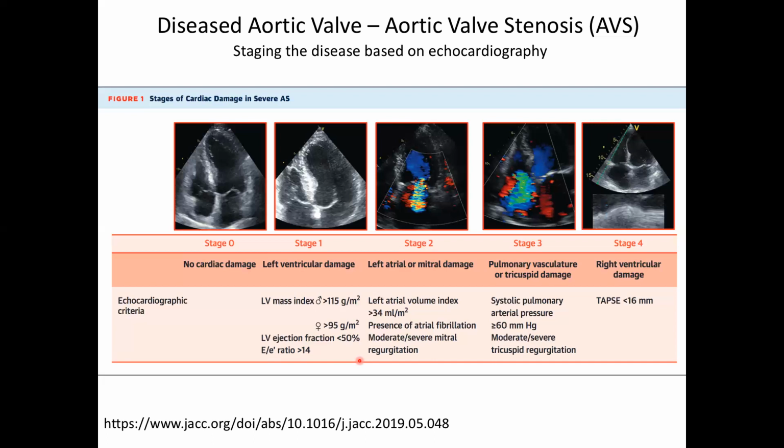Well, there are many, many people that have built certain phantoms, and agar gel or some kind of gel that doesn't dissolve is a really good place to start. And then you pin surfaces on that and you rotate them, you compress them, you put little markers in there that could be things that generate the speckle pattern. And so you test your resolution of how the speckle is coming together, et cetera.